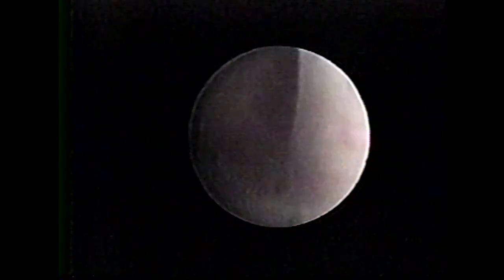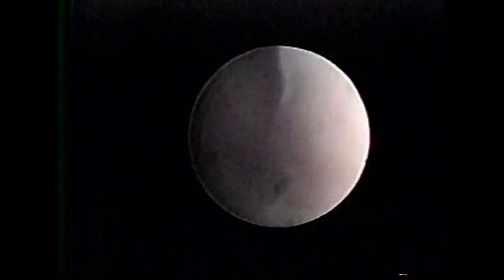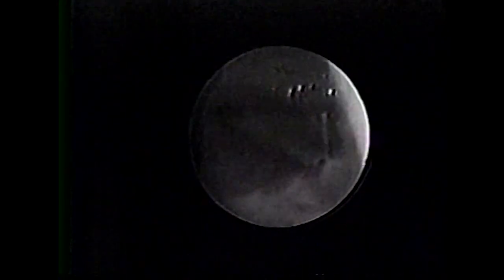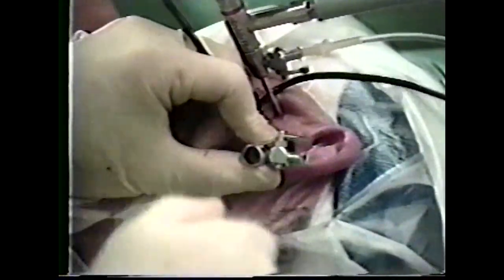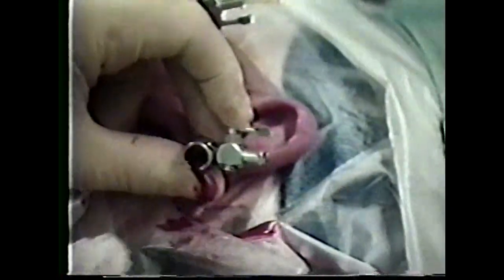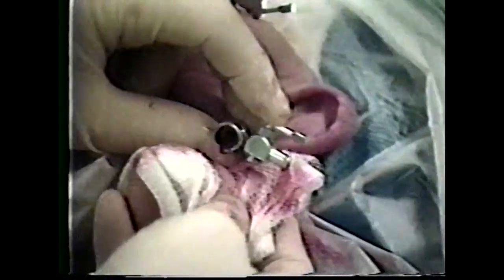Viewing through the infralaterally placed arthroscope, you will see the cannula and trocar enter the joint through the posterior wall. Removing the trocar from the cannula should produce a backflow of irrigation. Flush to eliminate blood clots and other debris.